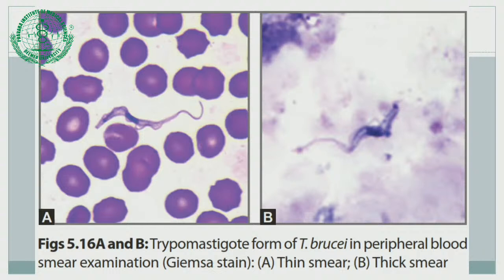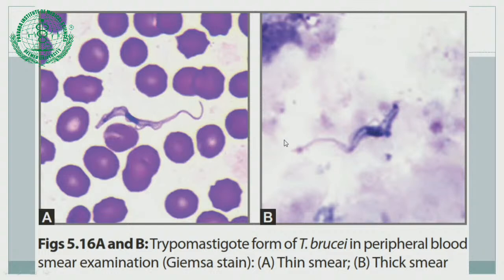This is the direct demonstration of the parasite. You can see the Giemsa-stained peripheral blood smear — image A is a thin smear and image B is a thick smear. Here you can see the parasite — the flagellated form, or trypomastigote.